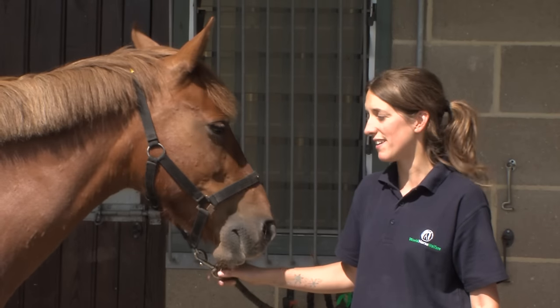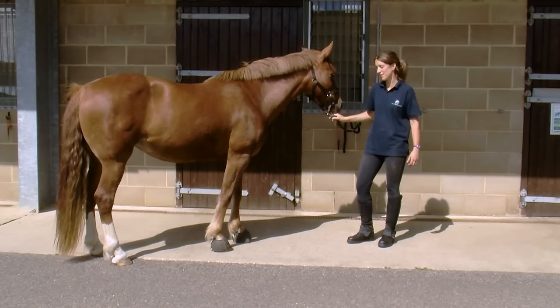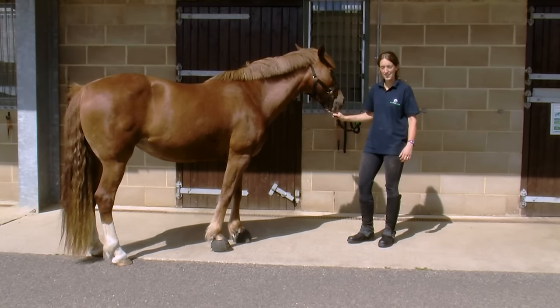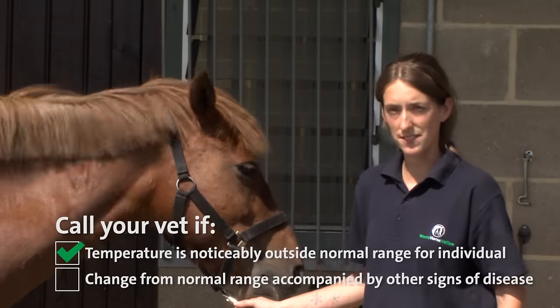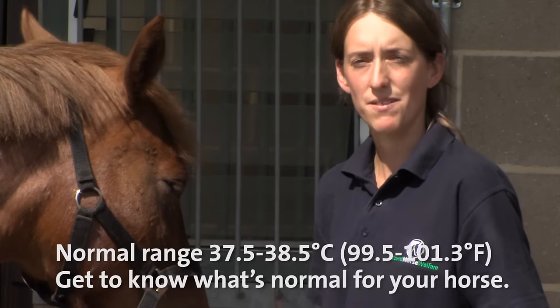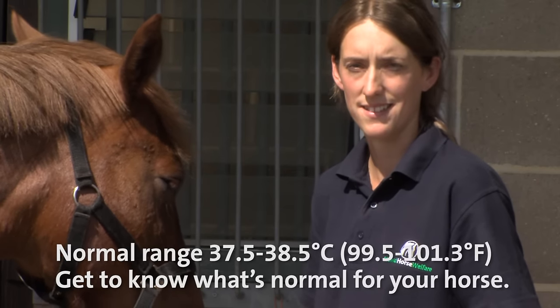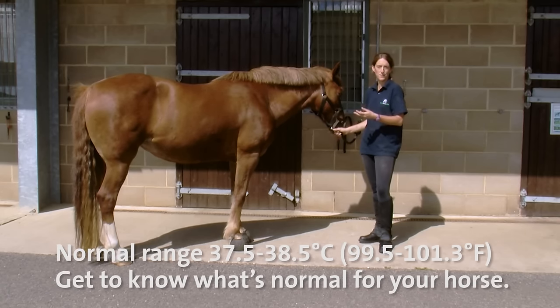Today Honey's temperature is 37.6 degrees Celsius, which is well within her normal range, and that means I have no concerns about her health today. If her temperature was significantly outside of its normal range, I would call my vet to give her a check over. The temperature range for the average horse ranges from 37.5 to 38.5 degrees Celsius. By regularly taking your horse's temperature, you'll be able to know what the normal range is for your horse.